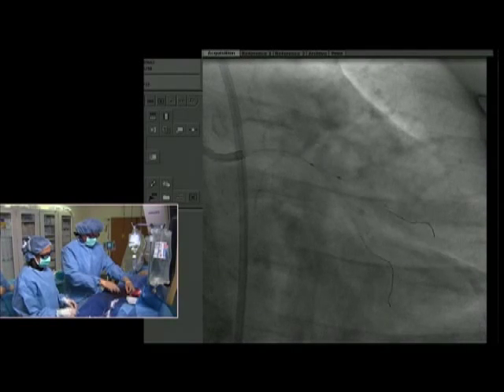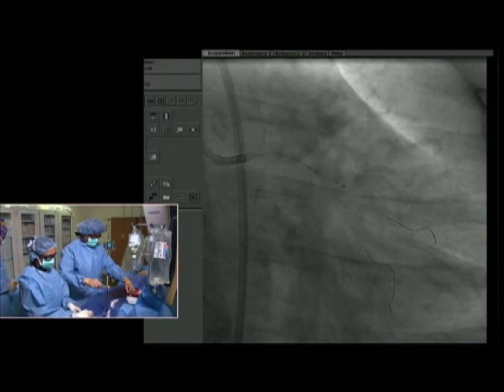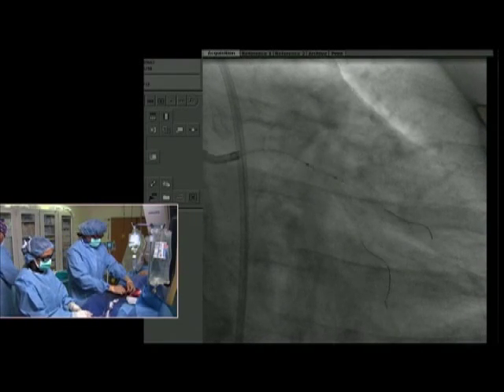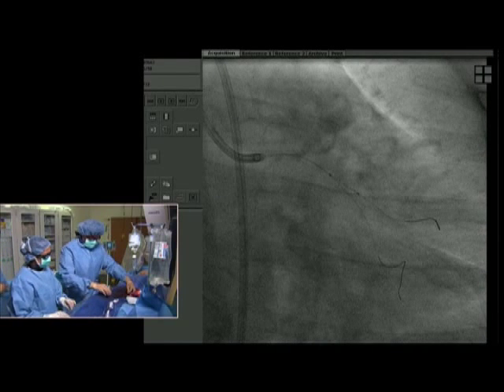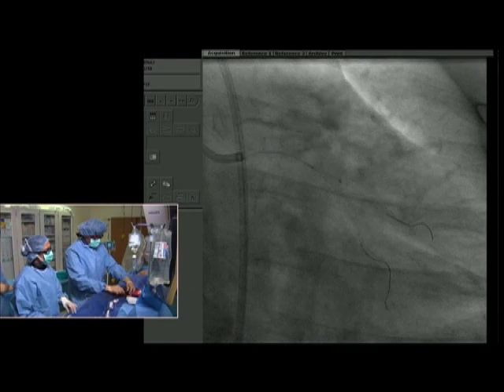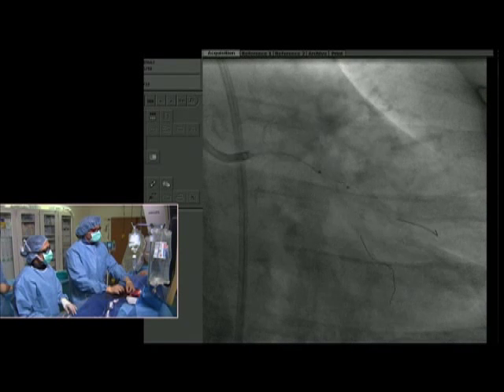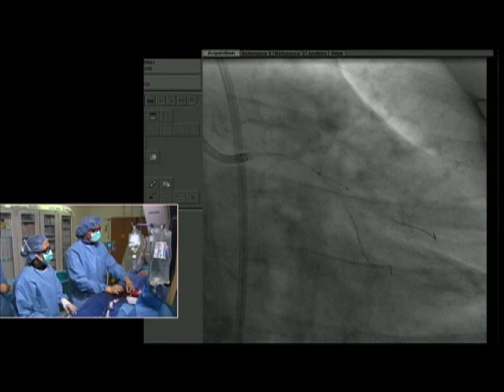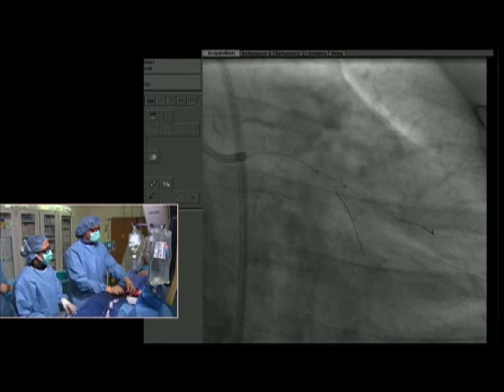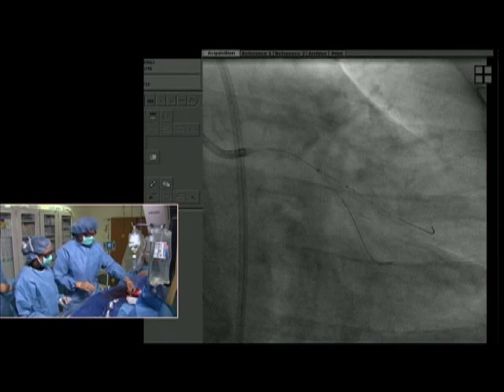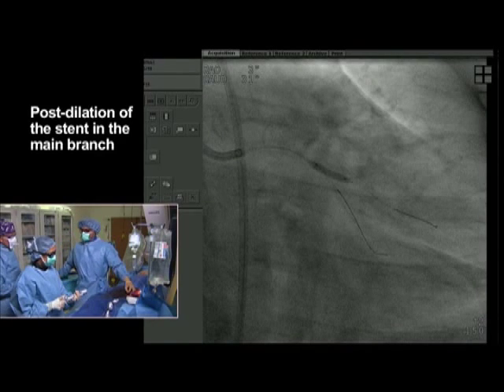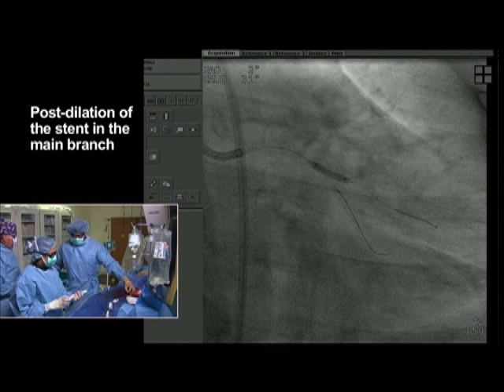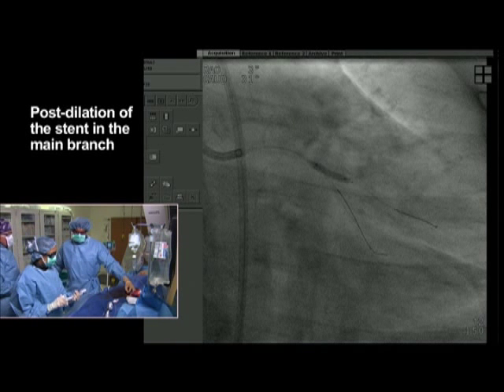We will remove this balloon, then pull this wire back slightly. Because of this angle, I will leave this wire jailed in place before we post-dilate. We'll go up to 12 atmospheres and re-expand the stent.